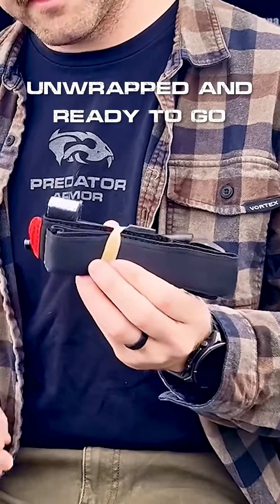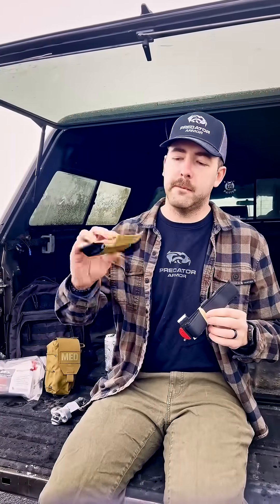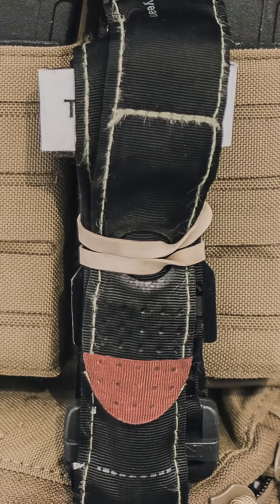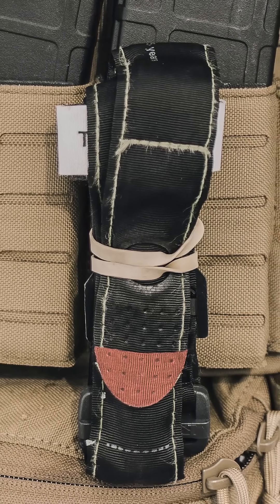You want to have something like this or something like this. One of our tourniquet pouches can be seen here. I personally prefer to have my tourniquet just rubber-banded. I find it super easy to get out that way.